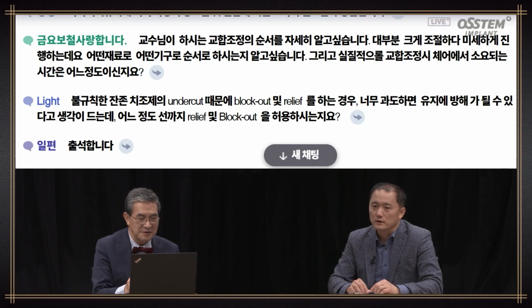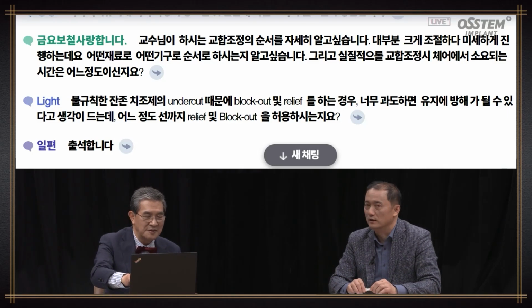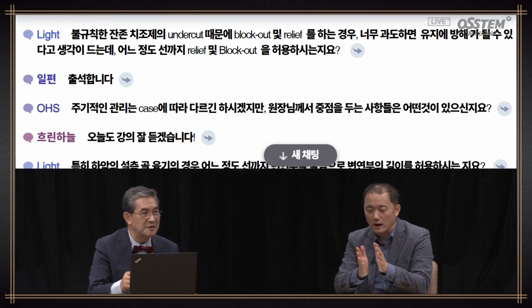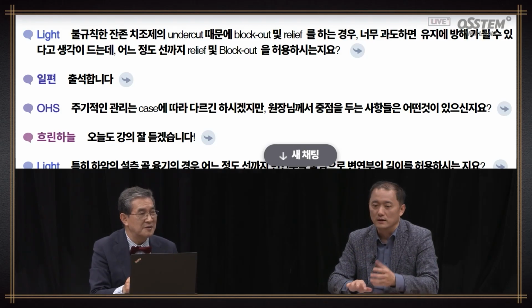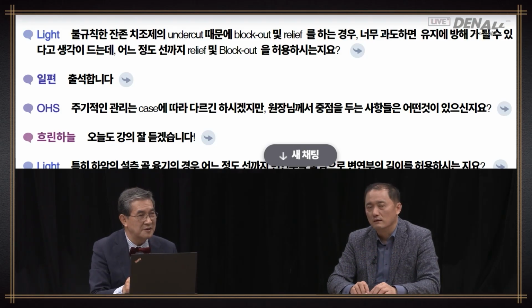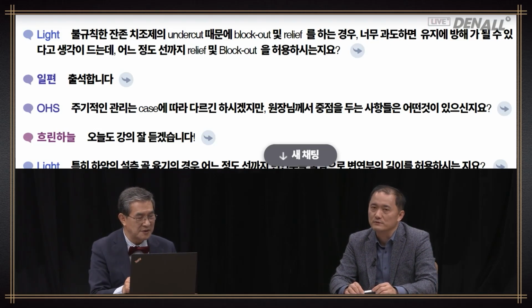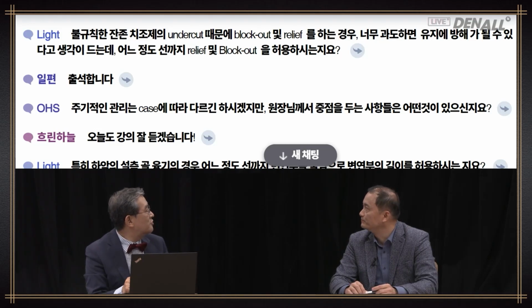Chair side time-wise, clinical remounting takes about 15 to 30 minutes, and if it's really not fitting, then 30 minutes. So on average, 15 minutes. In the mouth, if it's not really a fit, or if there's no support or stability, the occlusal adjustment really takes time. It becomes really unpredictable how long it's going to take. It could take an hour, or 30 minutes.